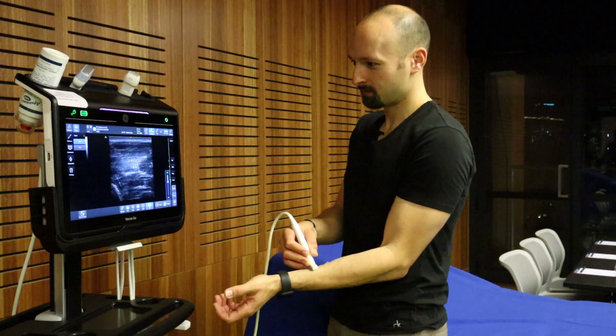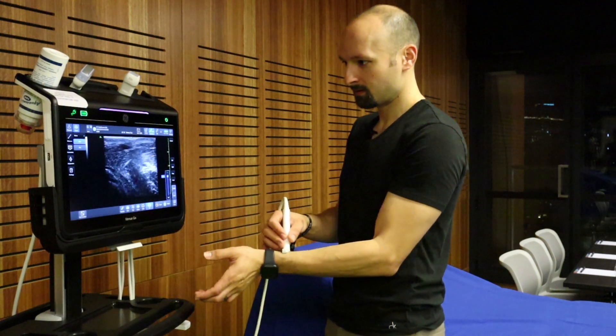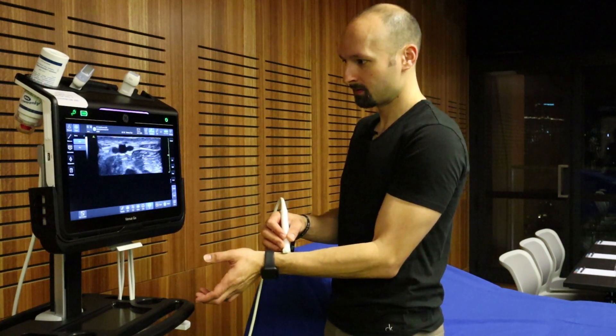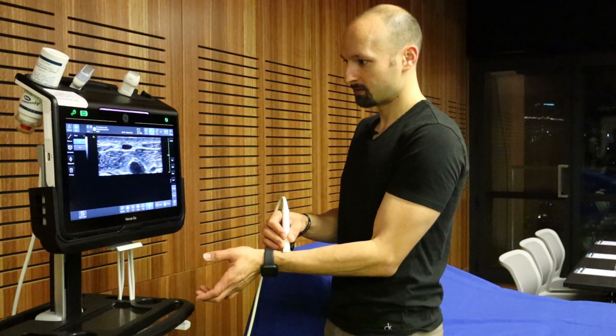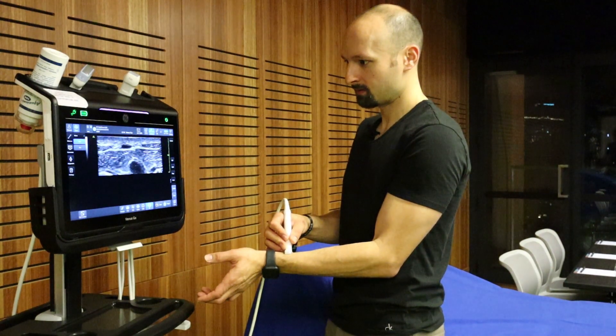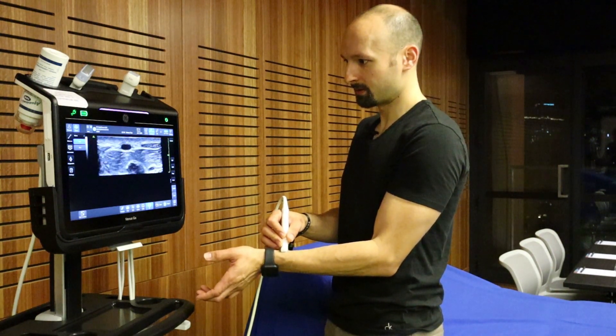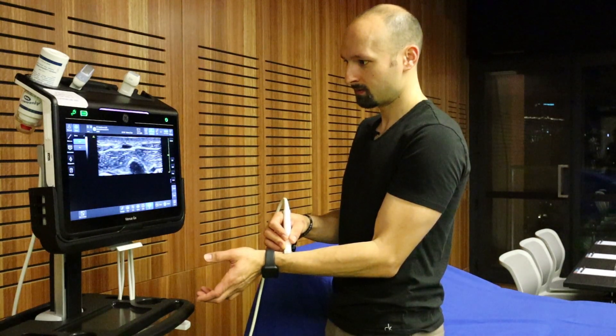The image quality where I tested it in Sydney is very similar to the image quality of the bigger Venue, which is pretty good. I did not test this in any patients with a high BMI, but in the simulated patients in the SMAC demo room, it worked really well.